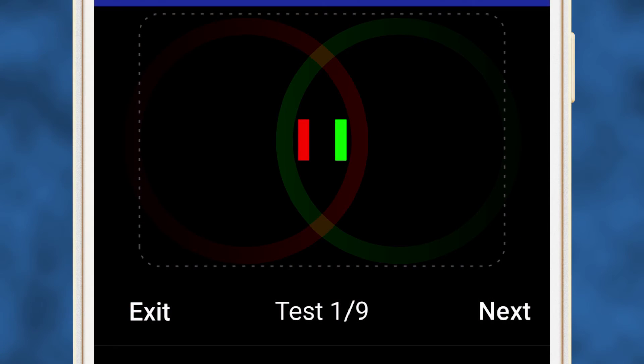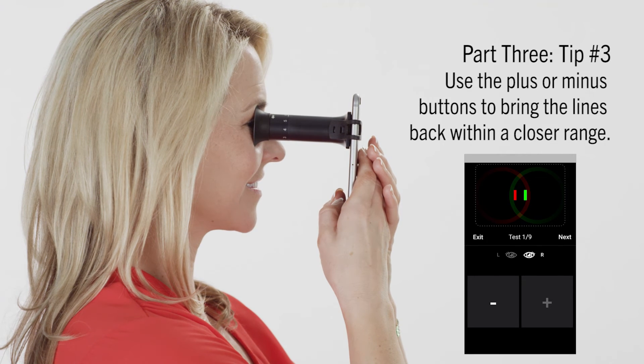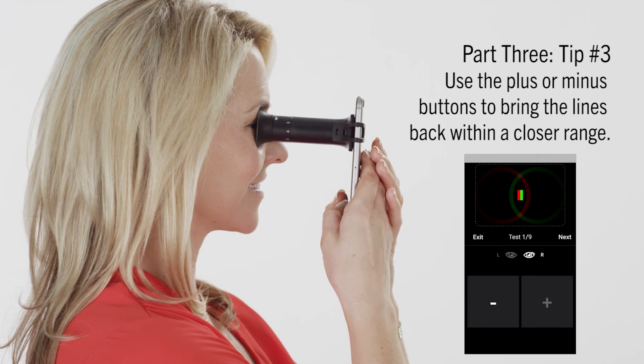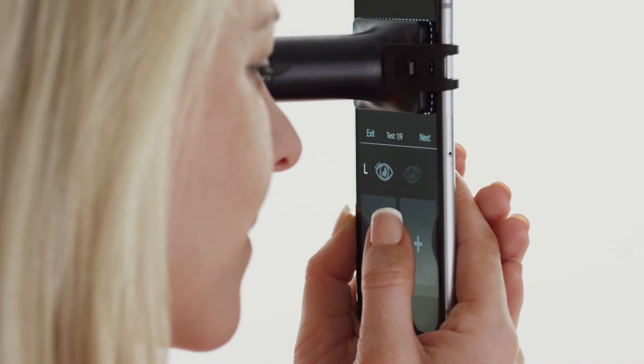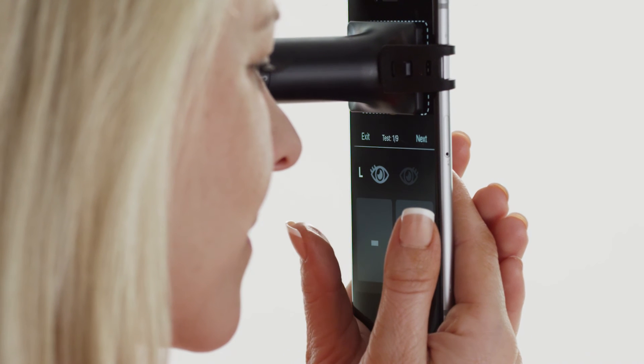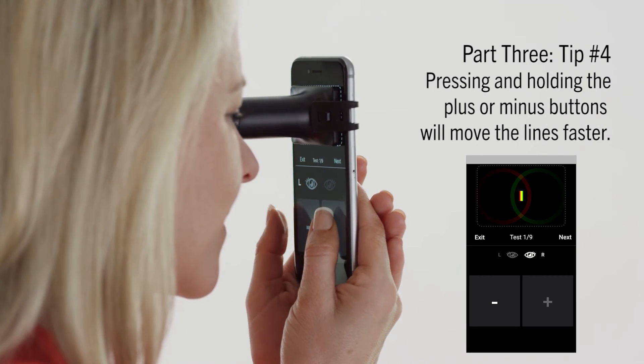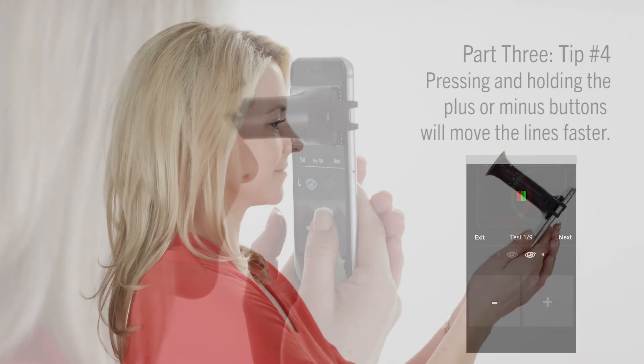When viewing the red and green lines on the testing screen, you'll notice that there is a maximum distance that the two lines can be apart from each other. If they're too far apart and have stopped moving in one direction, try tapping the other button — plus or minus — to move them back within a closer range. Pressing the minus or plus button moves the red and green lines closer or further apart. Pressing and holding down the plus or minus buttons, also known as long press, will move the lines faster.